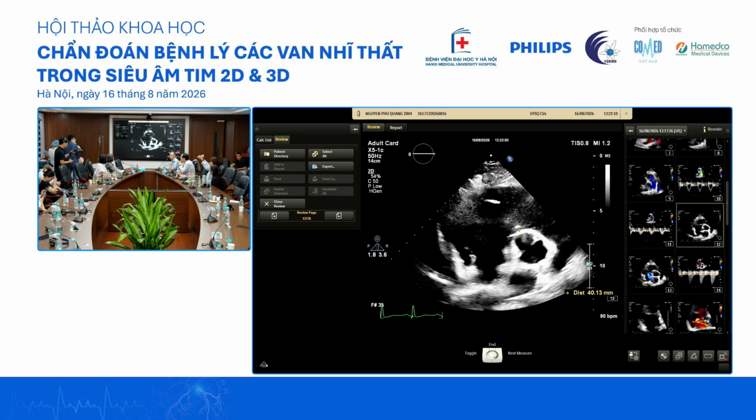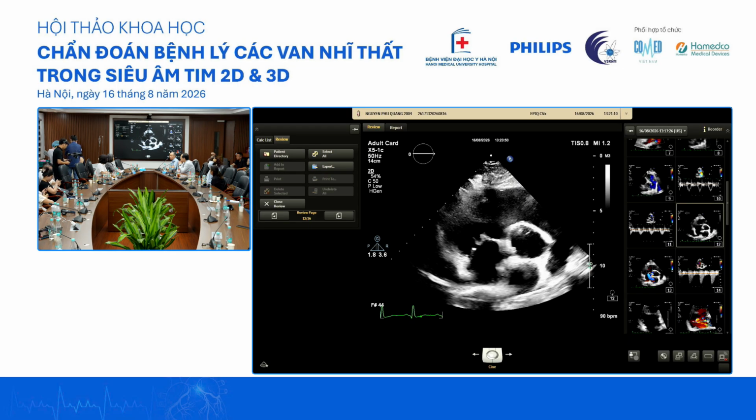at first I was a bit concerned about ARVC. You have RV remodeling, reduced RV function, and on three-dimensional echo, you can actually see that the normal end diastolic volume for a standard body surface area should be about 130 mils at most. We see 100 most of the time, but 130 is fine in young men who exercise a lot, but this one is 211. The 3D RVEF is 34%, so that's reduced.